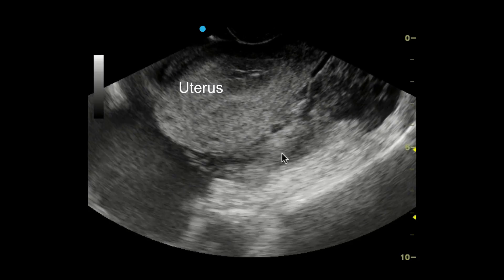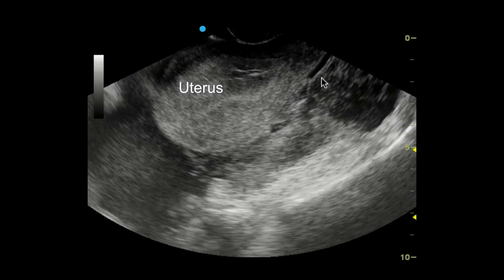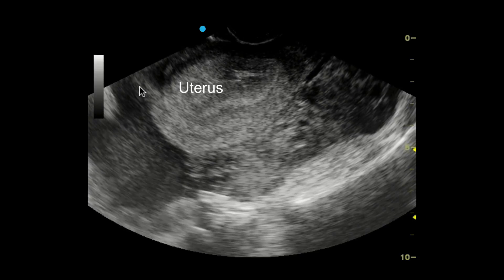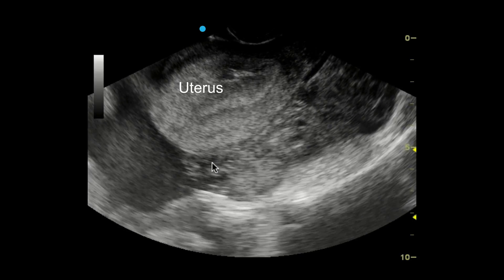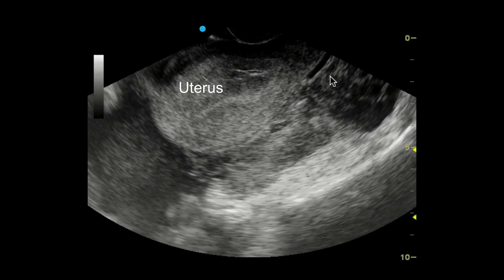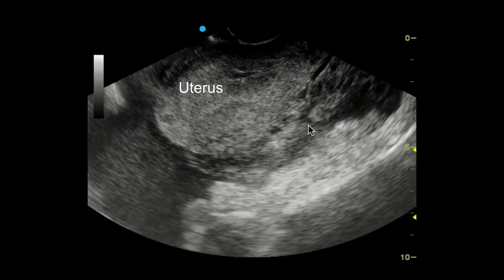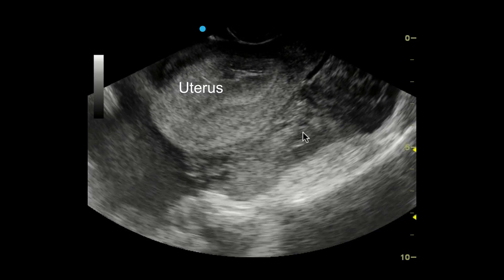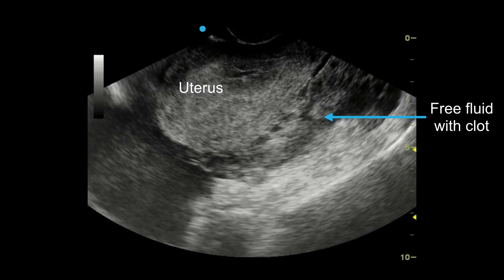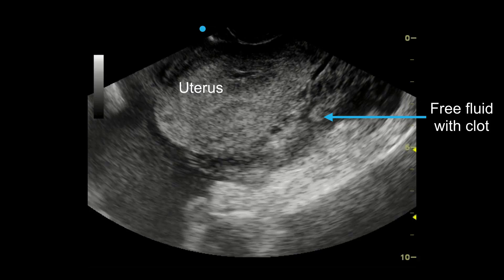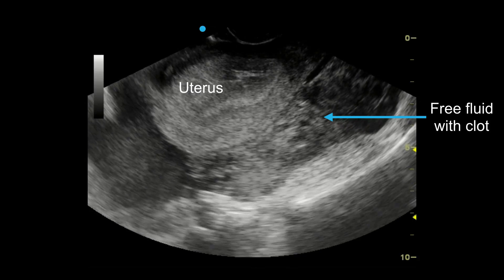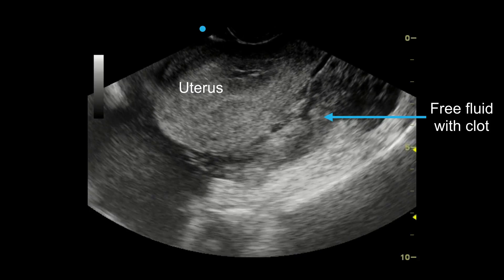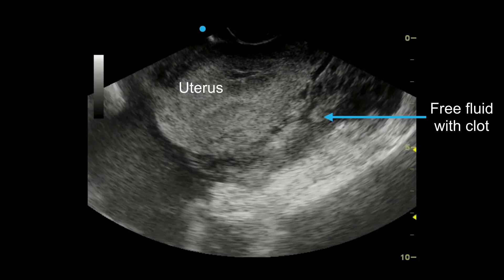How about this image? Once again, we're looking at a short axis view of your uterus. And surrounding your uterus, you'll notice anechoic material with some hyperechoic material within it. This is actually free fluid around your uterus with hyperechoic clots. This is a very concerning finding for a ruptured ectopic pregnancy.